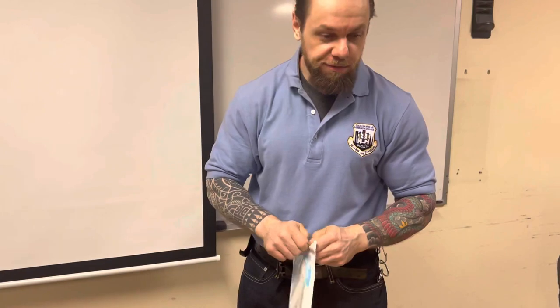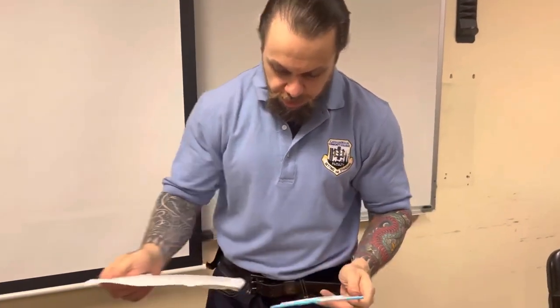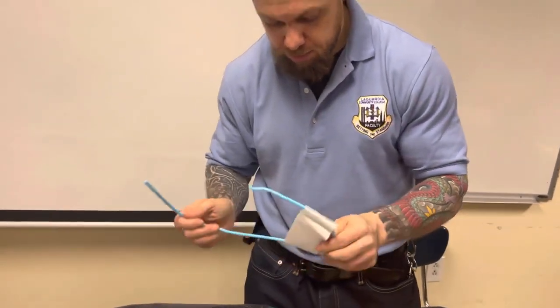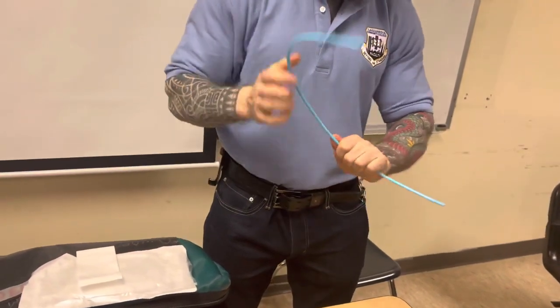Since we don't have video, we're going to use direct visualization. So this is going to be DL, called direct laryngoscopy, right? You're going to get a bougie, and then this is going to be employed. This is called the Coude tip. The Coude tip. So this tip, right?